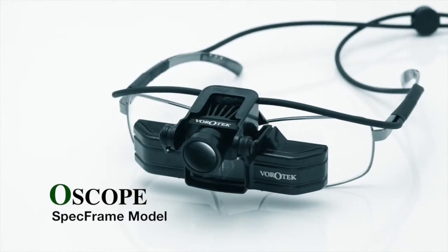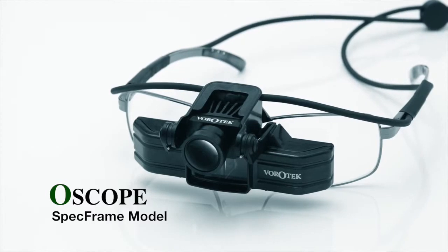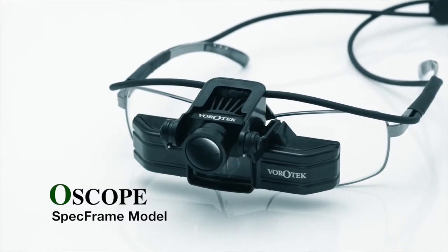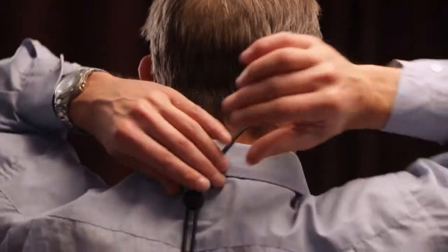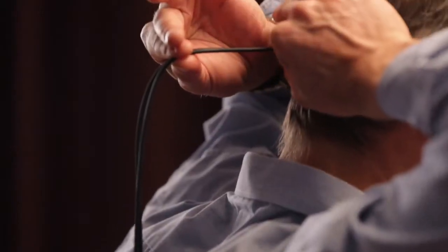This video is to ensure your scope is correctly set up and specifically aligned for optimal visual performance. With an adjustable spec frame model, ensuring correct alignment is paramount for optimum visualisation.